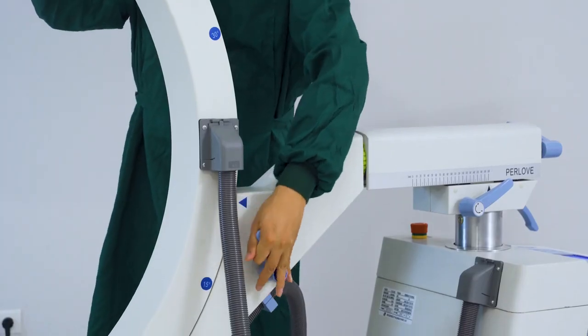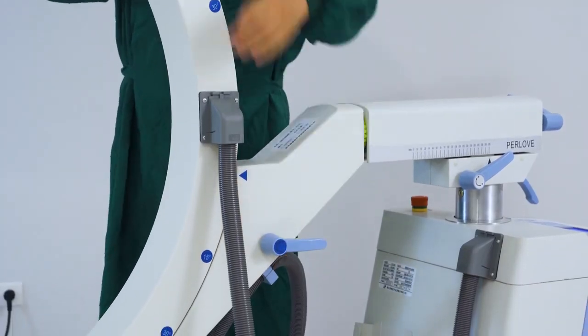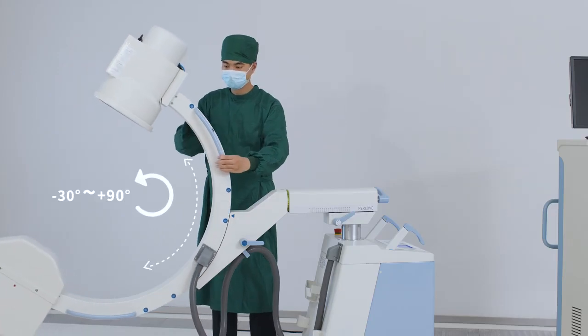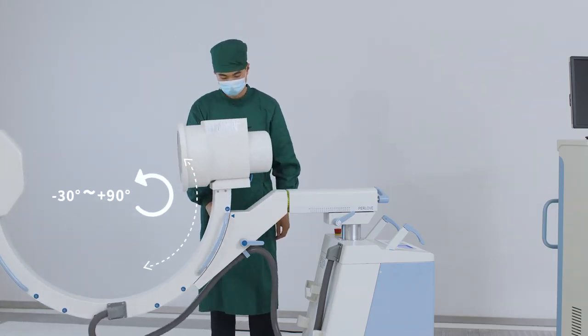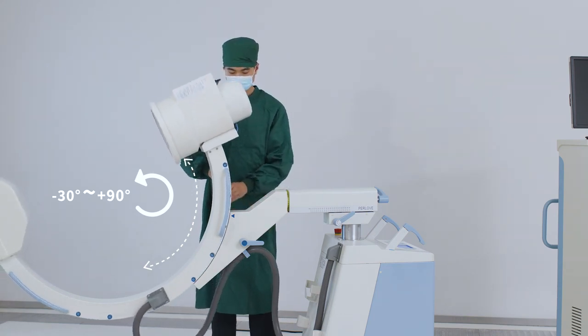When you grab the handlebar on the both sides of the frame, the C-Arm can be sliding along the frame from minus 30 degrees to positive 90 degrees.